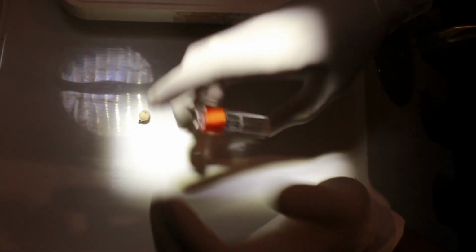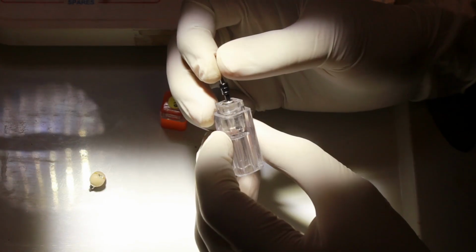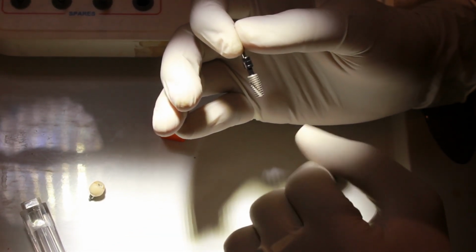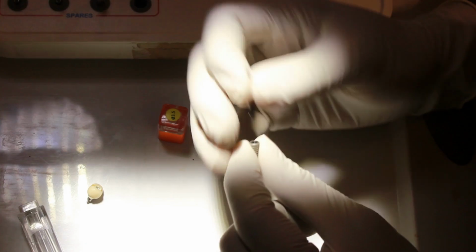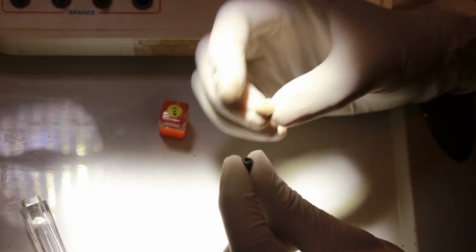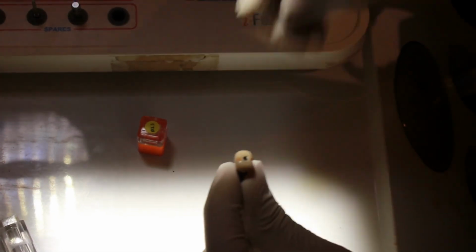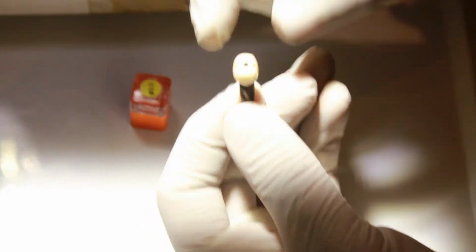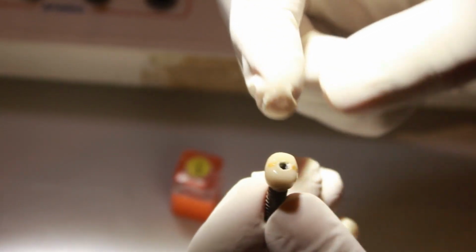This is a normal implant, and when we open it, we will find a screw inside it. So this is an implant. It goes inside the bone and gets fitted and integrated with the bone. Once this gets integrated and fixed with the bone, a tooth which is fabricated in the lab gets fixed over the implant. And there is also another screw present inside the tooth, which gets fitted onto the implant. And let us tighten it. So this is how a tooth gets attached with the implant, and the implant gets attached with the bone and helps you to replace your lost tooth.